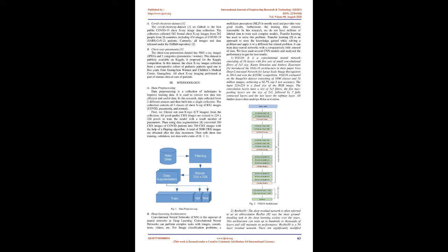Dataset. Deep learning requires a lot of training data because of the large number of parameters required to be tuned by the learning algorithm. In the deep learning approach, the image dataset is split into training data, validation data, and testing data. Then, the training dataset is used to train networks. After a network is trained, a test dataset is employed to evaluate network performance.